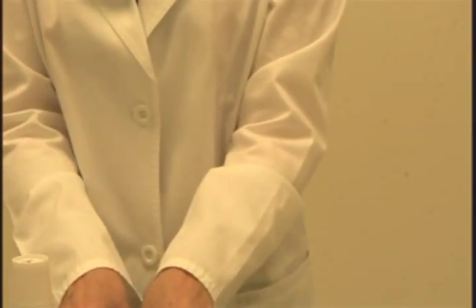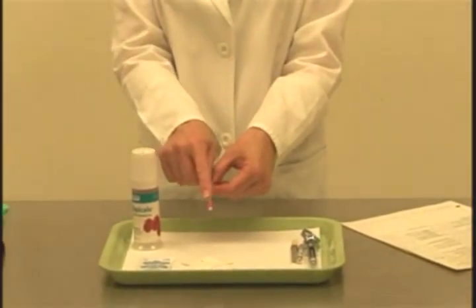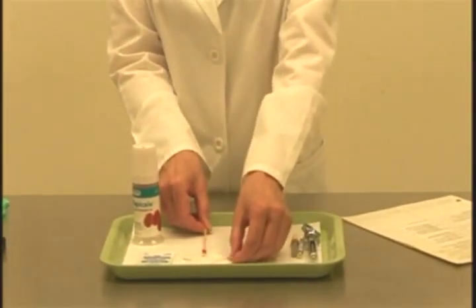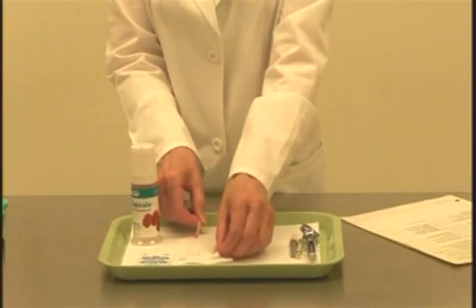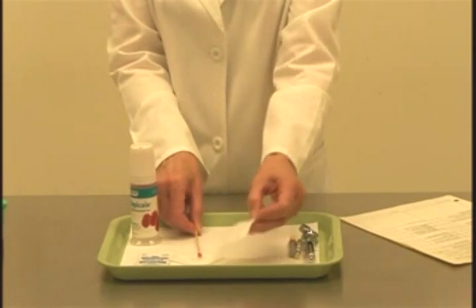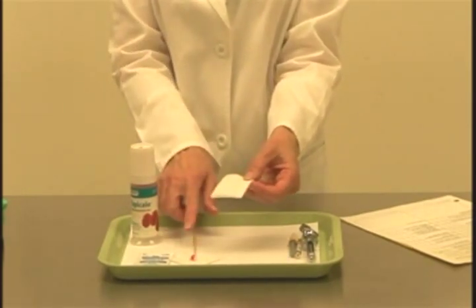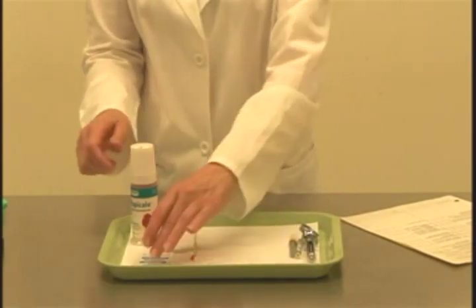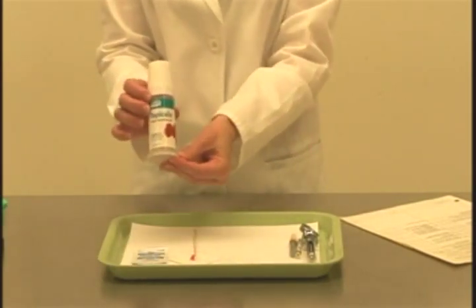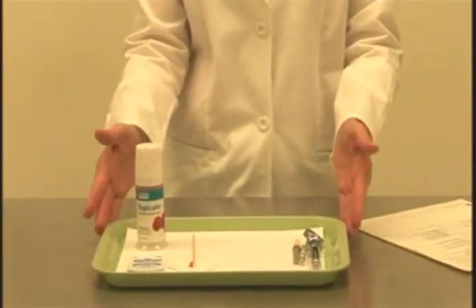I have a cotton tip applicator with topical anesthetic already dispensed on it — just a small amount on the end. I've also got two 2x2 gauze squares: one will be used to rest the cotton tip applicator on, and the other to wipe the mucosal tissues prior to placing the topical. I have an alcohol wipe and a container for the topical anesthetic gel. That is the armamentarium for the procedure.